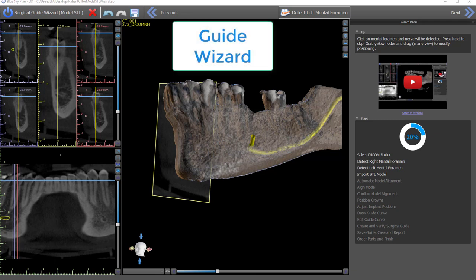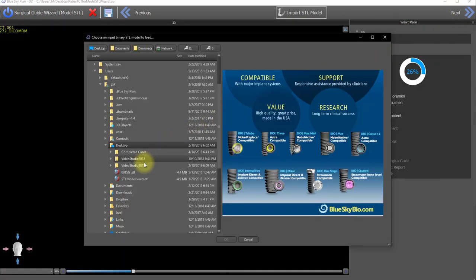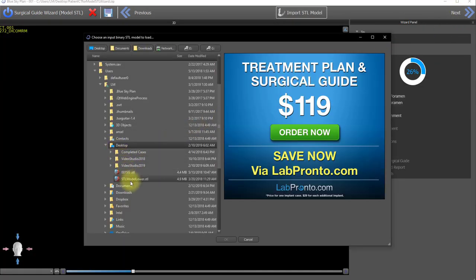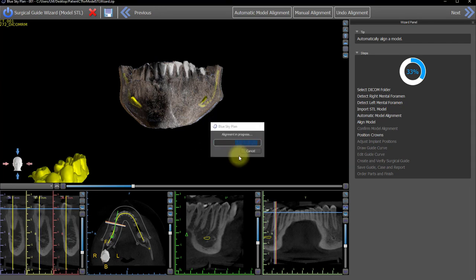Here in the wizard, I have a case already up on the screen. I've already placed the nerves and I'm ready to import the STL model as the next step. I'll click on Next to continue, and the navigation screen opens. I have my file here on the desktop — I'll just double-click on it. You'll see the automatic alignment feature; it's automatically identified as a mandible. Just double-check and simply click OK. It's thinking — it's going to take a short amount of time.